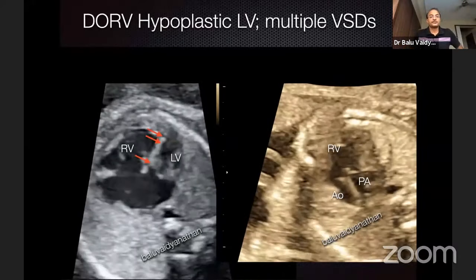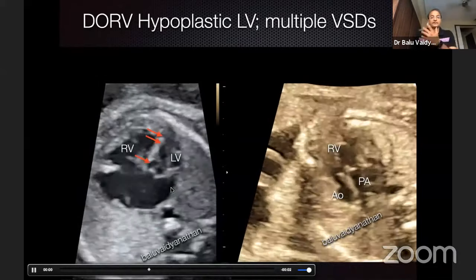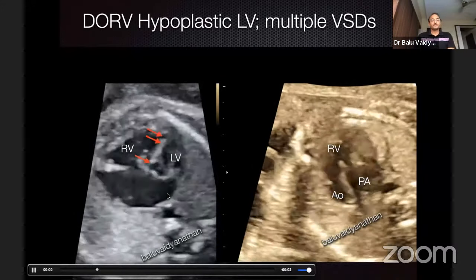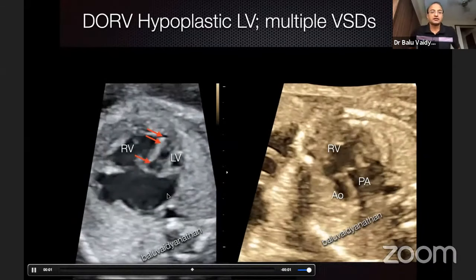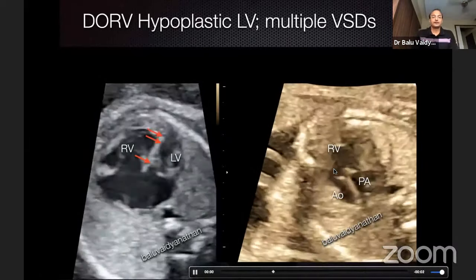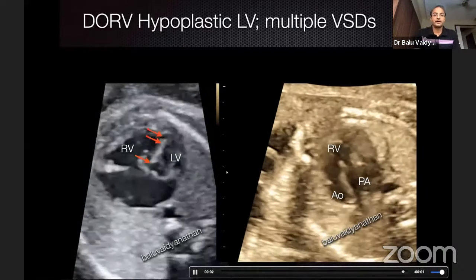And yesterday we discussed this mitral atresia thing. Now here the mitral valve is quite small, almost atretic. So mitral atresia is not something which is unique to HLHS. Here somebody looking at this 4-chamber view will call it hypoplastic left heart syndrome. But it is not hypoplastic left heart syndrome, because the only features which are there are the small mitral valve and the small LV. But when we look at the outflows, you see that there is absolutely no aortic atresia whatsoever. So there is a double outlet from the right ventricle. So this is the point which we were alluding to yesterday. So obviously this case will only go for a univentricular repair.